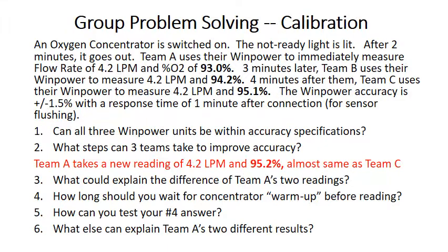All right, here's your opportunity for group problem solving, troubleshooting, using your collective knowledge. So once again, get into your groups of 2 or 3 people. Everything is self-explanatory on this slide. I need for you to answer questions 1 through 6. And once you have decided as a small group, we'll want you to present your findings by choosing someone to present your findings to the class at large.